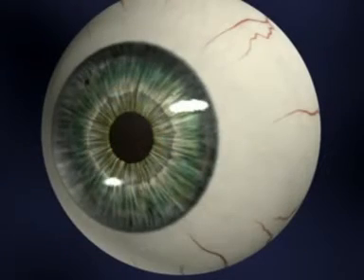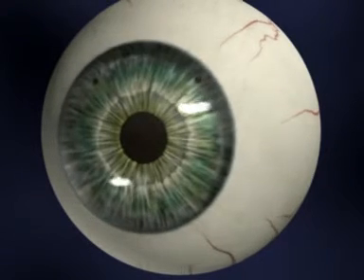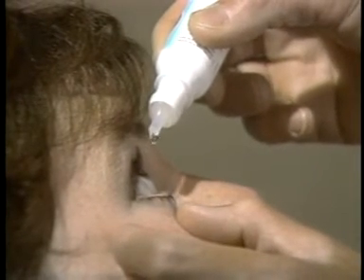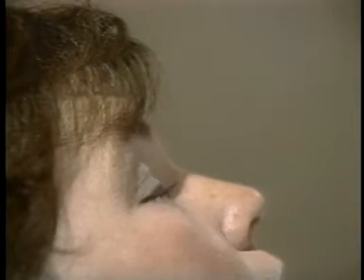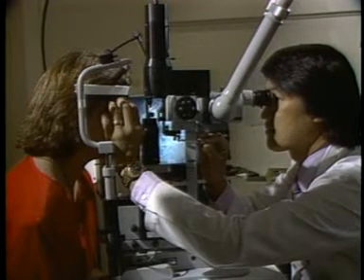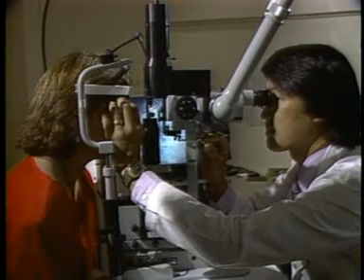Two PIs should be placed superiorly, 90 degrees apart in the mid-periphery. Each PI should be at least 0.5 mm in diameter. Typical post-laser treatment medication includes prednisolone acetate 1% drops 4 times per day for 7 days. It should be noted that these procedures generate the most patient complaints.